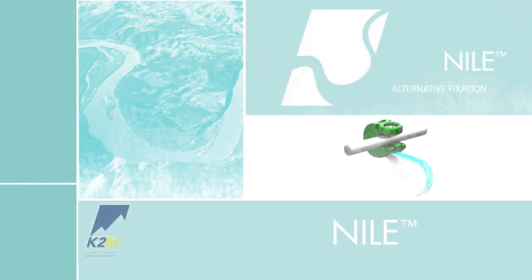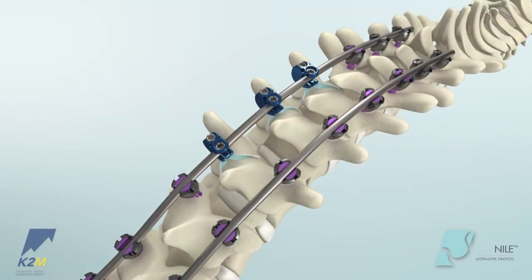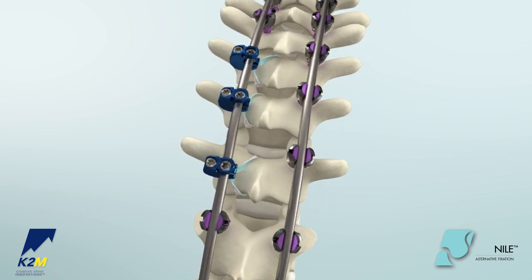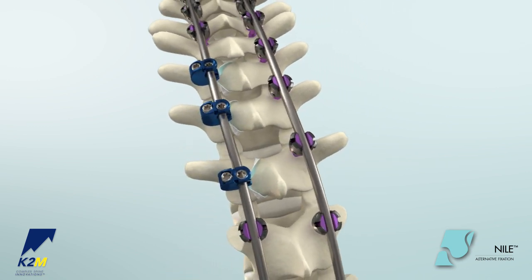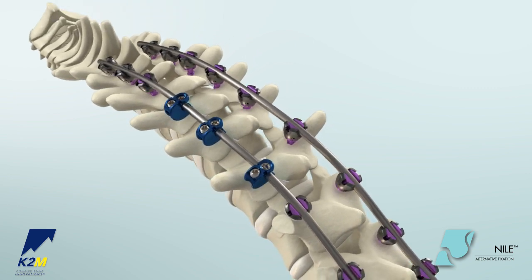Introducing the Nile Alternative Fixation System from K2M, Complex Spine Innovations. The Nile Alternative Fixation System is intended to provide stabilization between the spine and the rod and to allow for reduction, translation, compression, and distraction while sparing the anatomy.